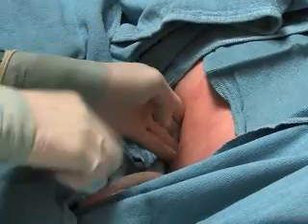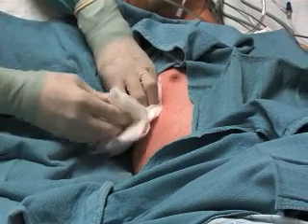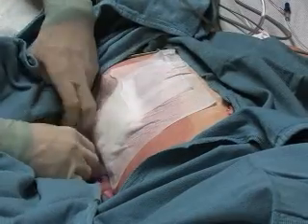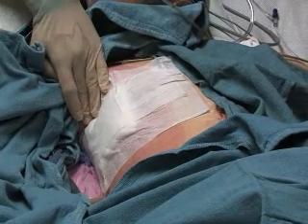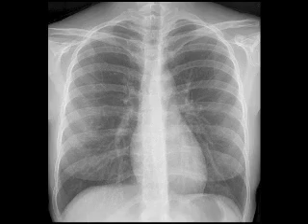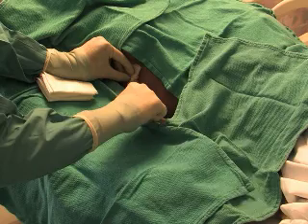quickly seal the incision site with a petroleum-based gauze, reinforced with several pieces of regular gauze on top of it. Secure the site with a pressure dressing. Additional sutures may be required to close the incision. A follow-up chest X-ray should be obtained 12 to 24 hours after the tube has been removed. Closely inspect for any suggestion of a new pneumothorax.